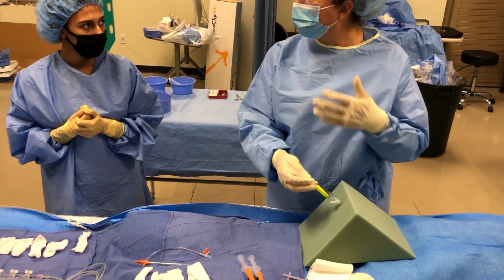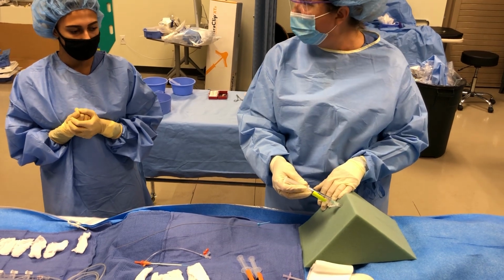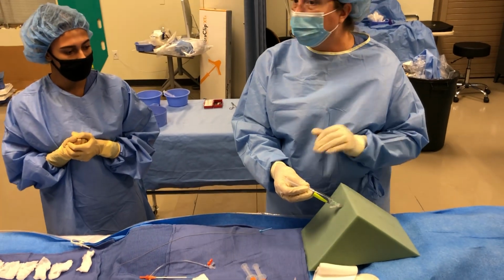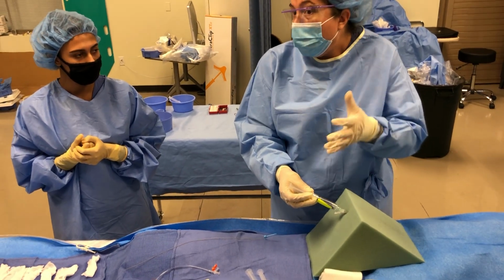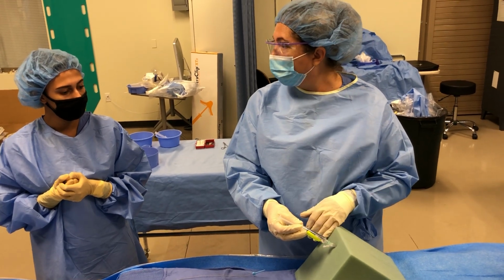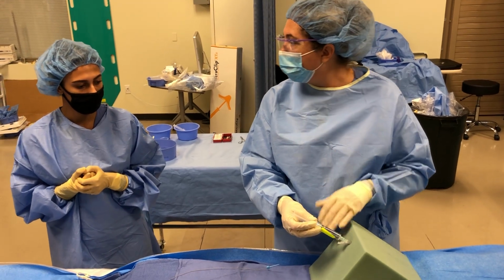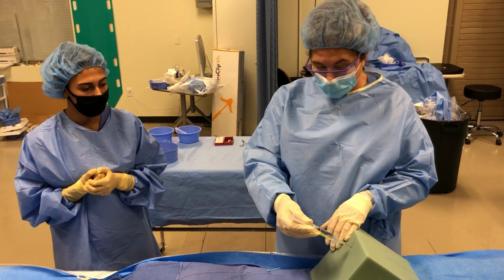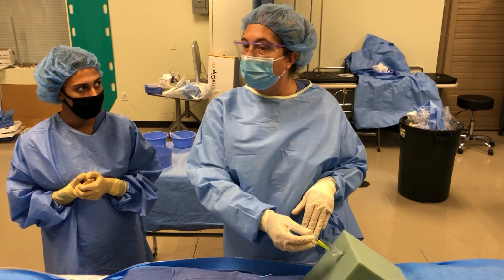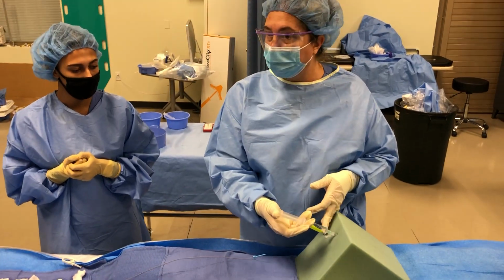And I'm going to be asking you these kinds of questions also while we're doing our practical. What do we need to do now that I put the needle in? You're going to tell me they need to aspirate. Why do they need to aspirate? We want to make sure we're not in a vessel. How would I know you're in a vessel? You're going to get blood return. If you don't get blood return, you're in the tissue. If you get blood return, you're in a vessel. What do you need to do? Pull it out, reposition, aspirate again. Make sure they're in the tissue. Once they know they're in the tissue, then they can administer the lidocaine.